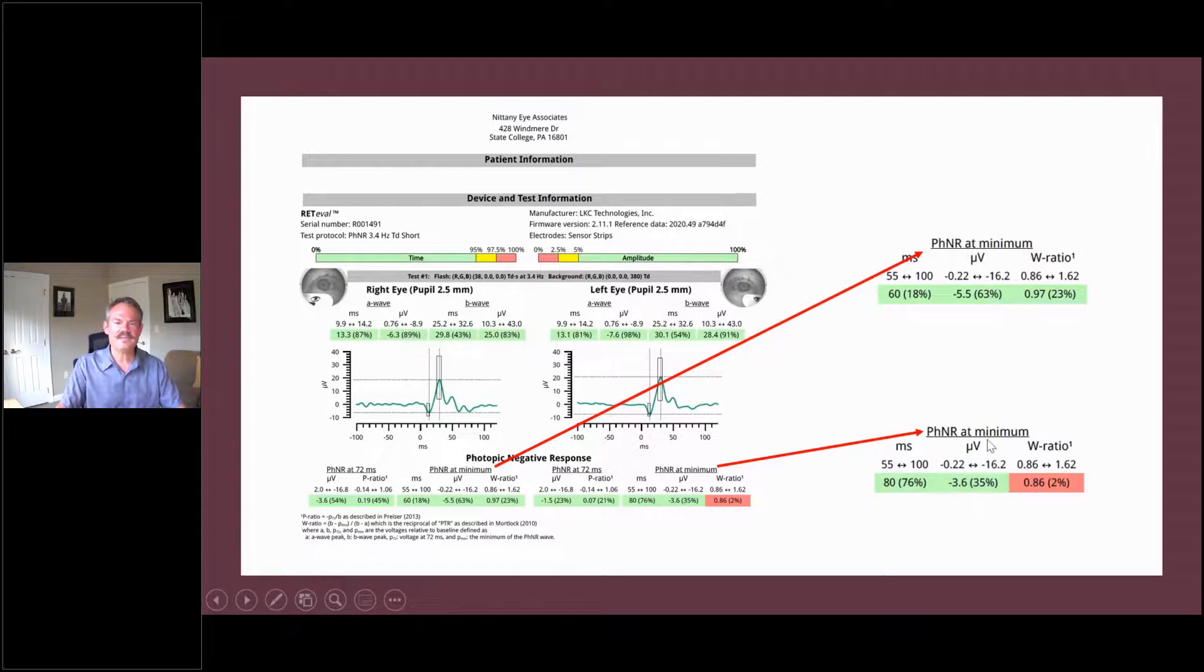So even though we're only being flagged on the W ratio in the left eye, when we dig into these percentages and the differences between the two, the difference between 76% and 18% is huge, and between 35% and 63%. That's the information I need to say there's definitely something happening in this left eye. This left eye is being stressed. We need to take more aggressive action to get this pressure down.